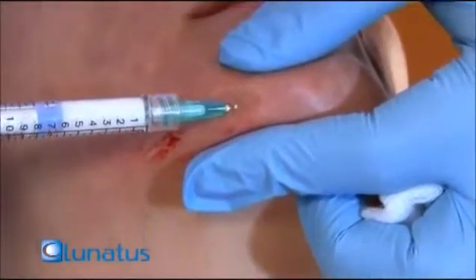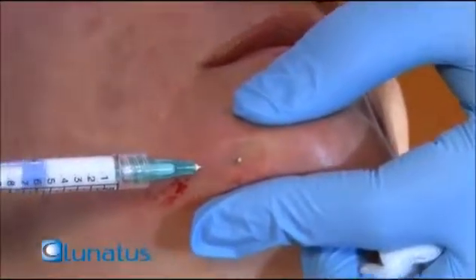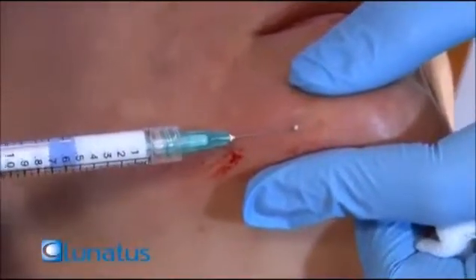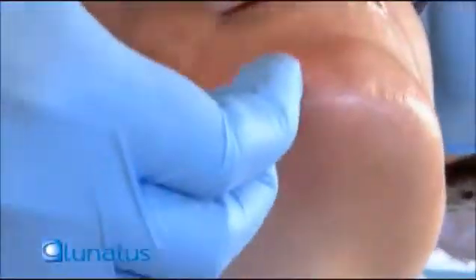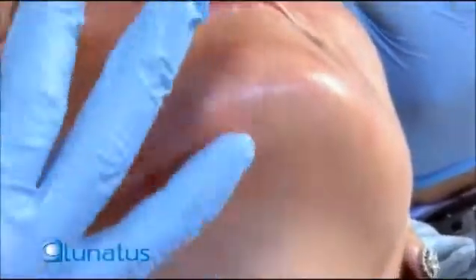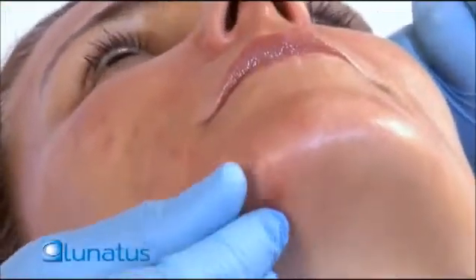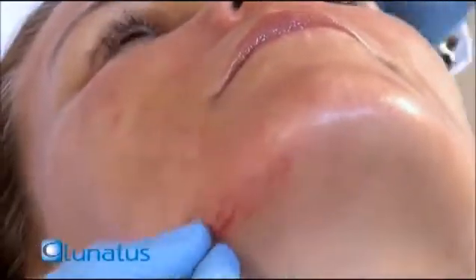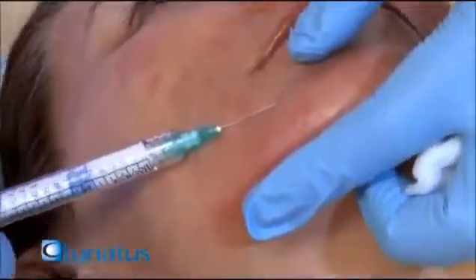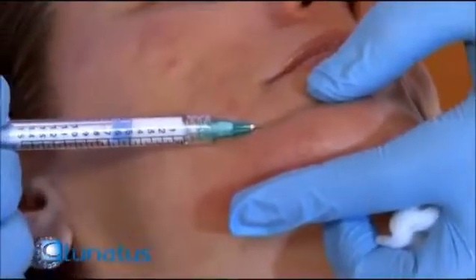You want to be very careful not to inject too much material. You don't want too much of a chiseled look in a woman, because women basically have softer features than men. You don't want to create that superman jaw in a woman — you want her jaw sharp and edgy, but at the same time softer. So avoid injecting a lot of material in the jaw area. Then I'm going to inject just a very tiny amount in the chin to give a little bit more volume.